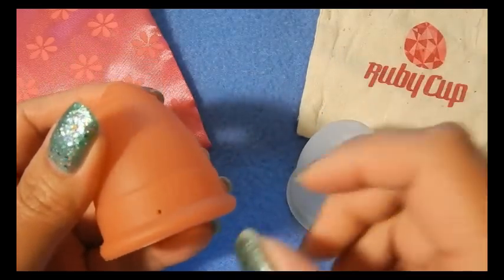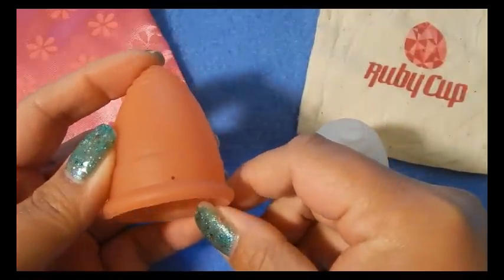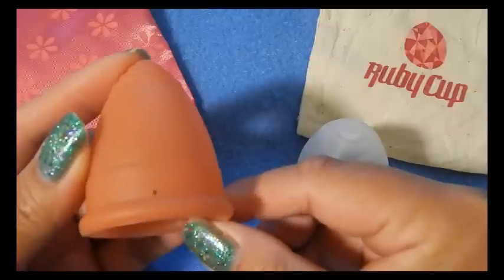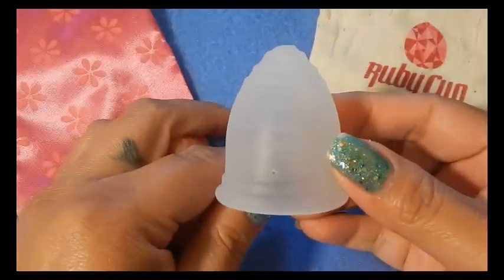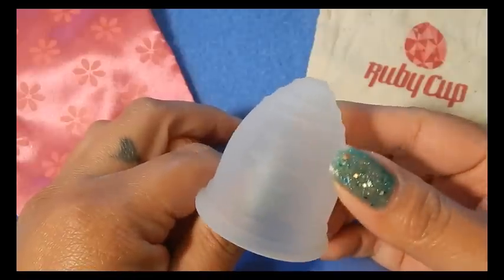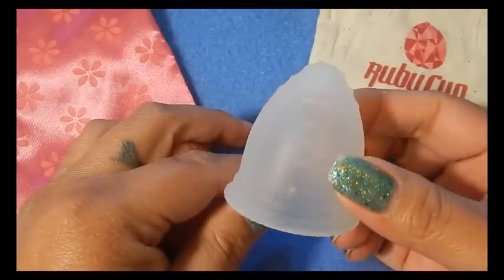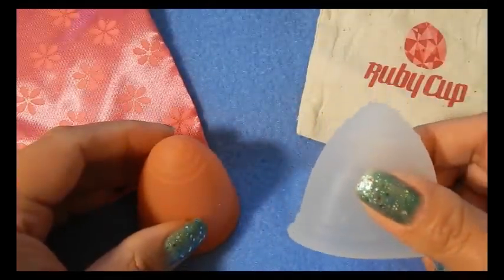The Lunette has five different colors and I have the coral with me today. They also have two different sizes: size one and size two. This is the size two, which is the larger of the two sizes. The Ruby cup comes in three different colors — there's a translucent white frosted color, and then a blue and a pink, but I'm not sure if those are limited or if they'll carry them all the time. The Ruby cup only comes in this one size.